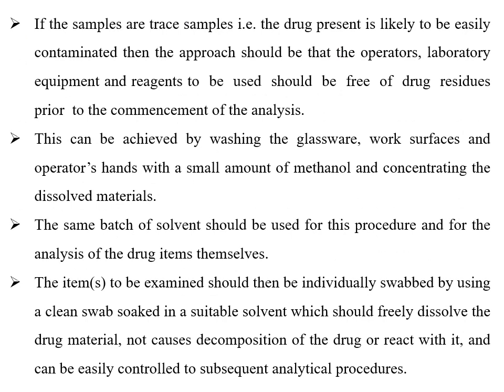If the samples are trace samples, that is, a drug which is likely to be easily contaminated, then the approach should be that the operator, laboratory equipment, and the reagents to be used should be free from drug residues prior to the commencement of the analysis. This can be achieved by washing the glassware, work surfaces, and operator's hands with a small amount of methanol and concentrating the dissolved materials. The same batch of the solvent should be used for this procedure and for the analysis of the drug items themselves.